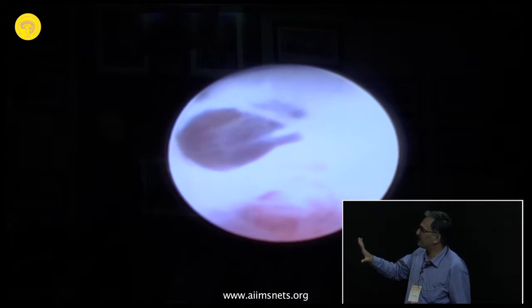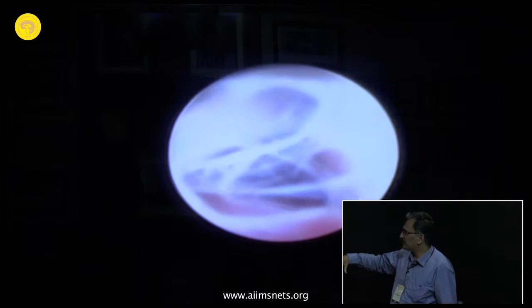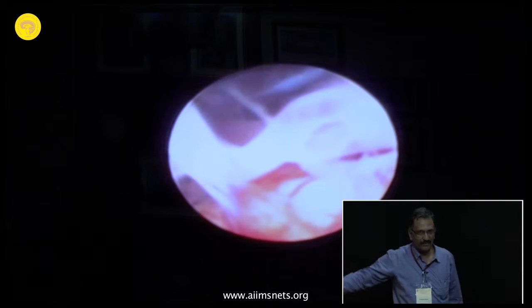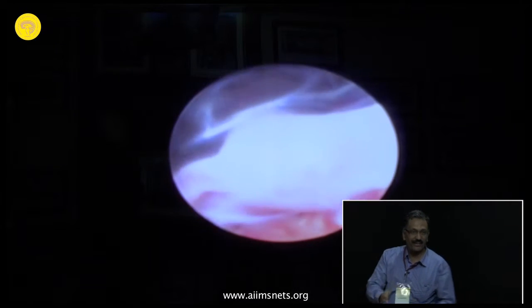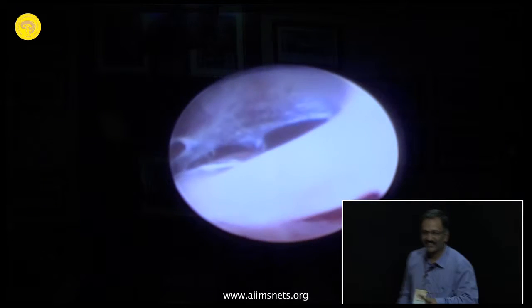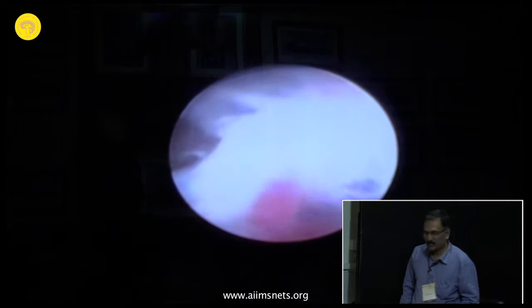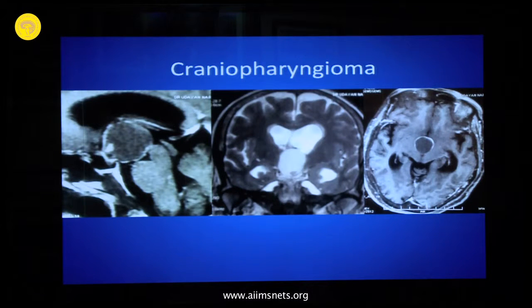See, now you see the difference. Suddenly you will be able to see the vessels, you will be able to see the cisterns, you will get a reasonably good picture. So this is one interesting situation. Now we come to another very interesting situation, the next one, this situation, right?